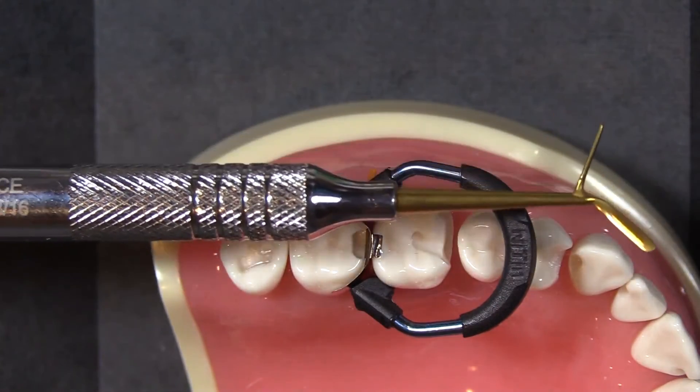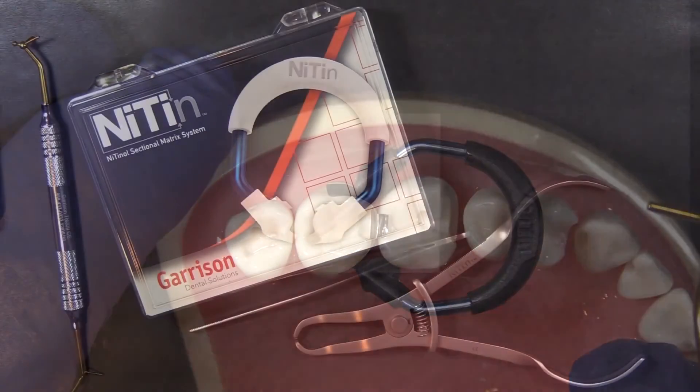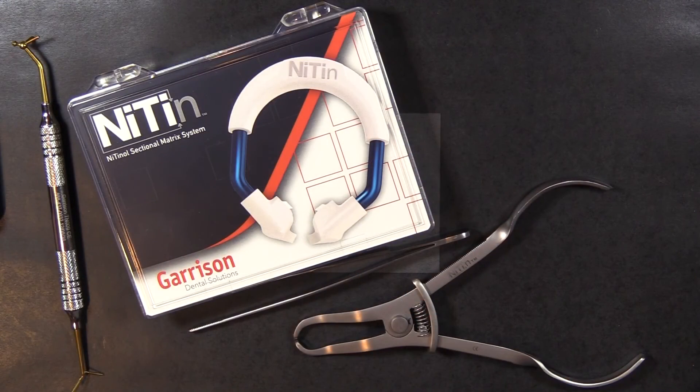This instrument, by the way, is the Garrison multi-function composite instrument — you can get that from Curion as well, it's our most popular composite instrument. So that's ready to be filled. That's the Nitin sectional matrix system from Garrison Dental Solutions — thank you very much on behalf of Garrison and Curion for taking a look at this today.